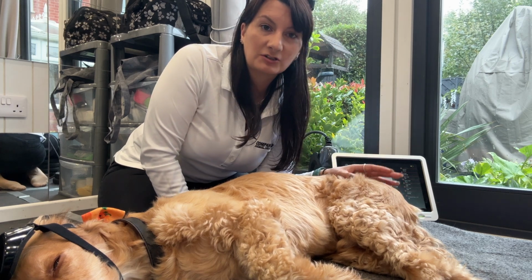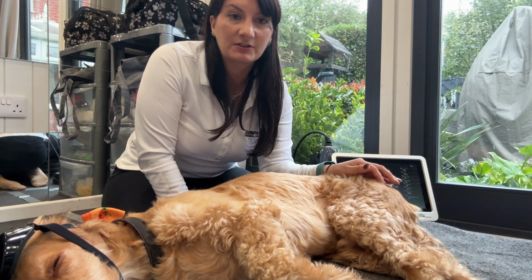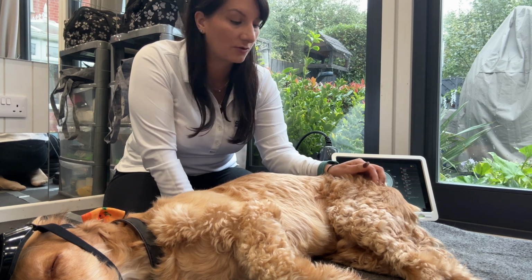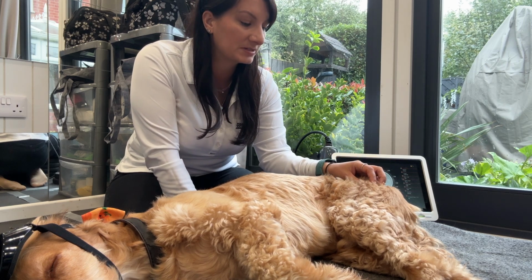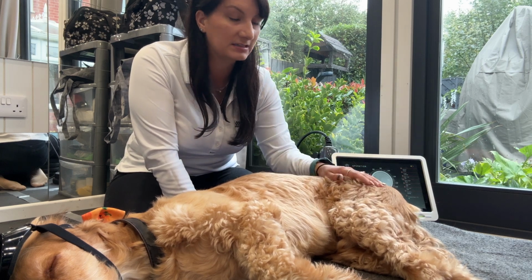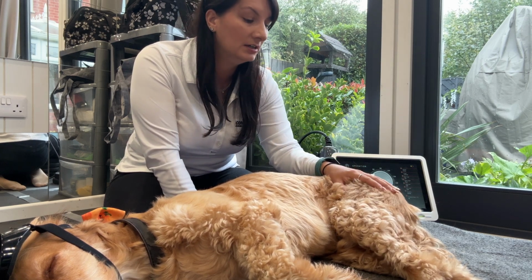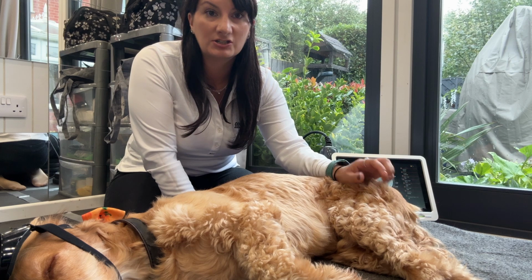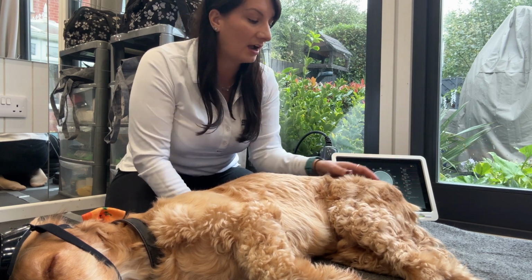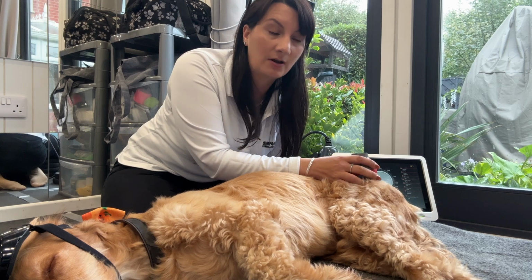So, tips for when you are treating an area: never just focus on a couple of areas around the joint itself. If, for example, we're treating this hip dysplasia, there's so much more that's being impacted than just this area. Take into account the patient. We've got quite long fur here, so how am I going to apply it?